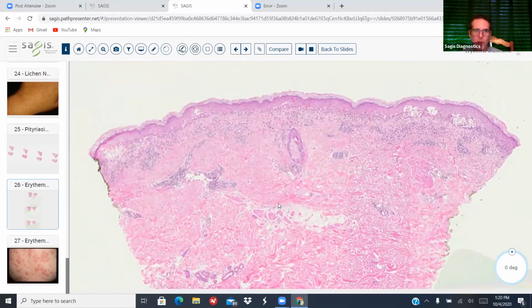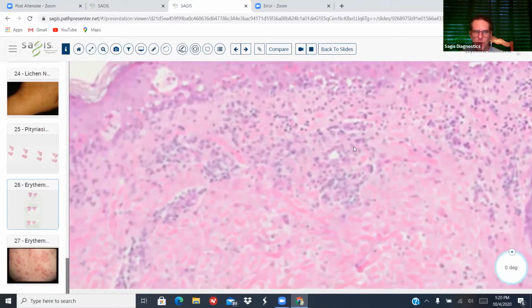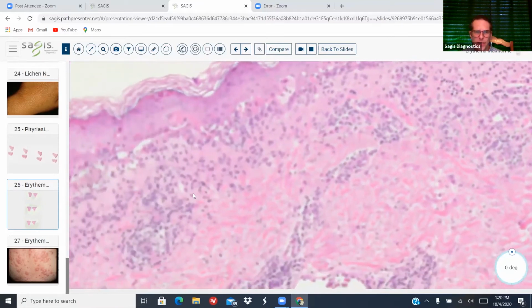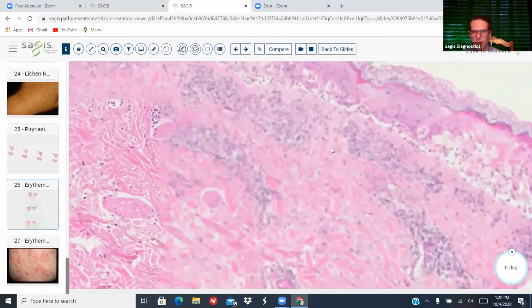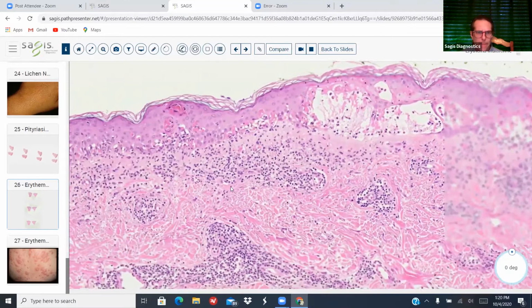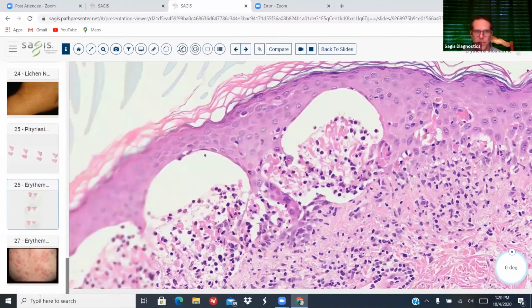All right, so here we have superficial infiltrate. If we look, and I'm wondering if this slide's warped because I'm having a hard time. I don't know if you guys had a hard time getting it into focus. It's a mostly lymphocytic infiltrate, and there's numerous necrotic keratinocytes. Let me see if I can go to another one that we can actually get this in focus. Here we go. All right, so all lymphocytes, abundant necrotic keratinocytes, sometimes at all levels, forming spaces.